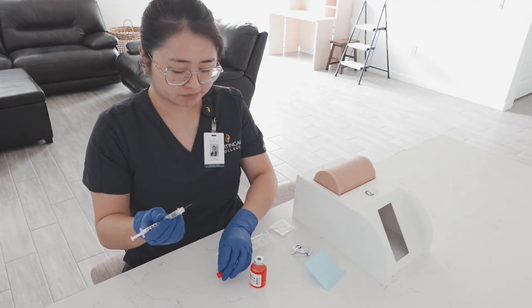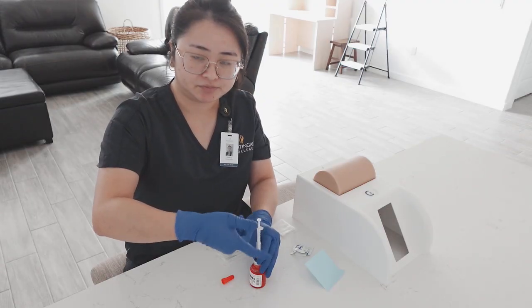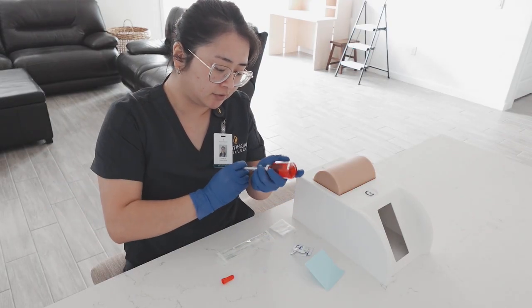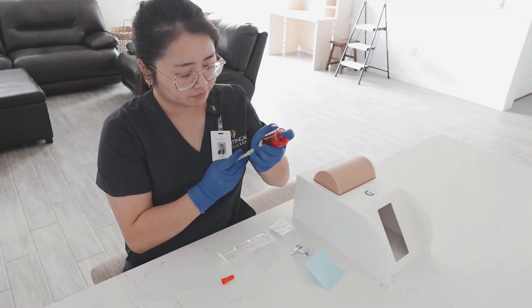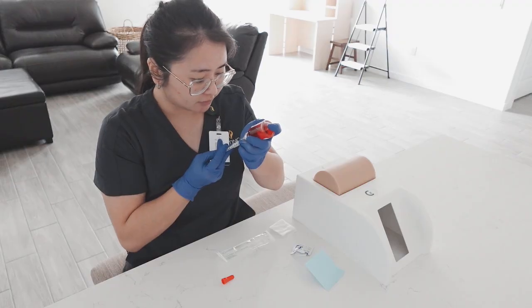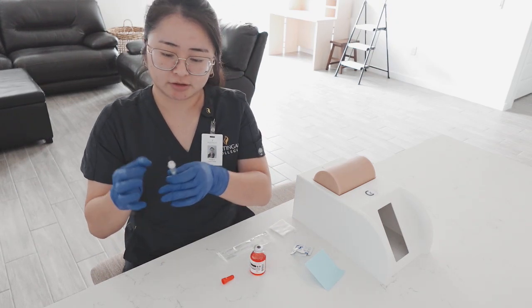And I'm going to take off the cap, put it down, insert the needle, inject the 0.1 air into the vial, invert the vial, and draw up 0.1 milliliters. We want to make sure that there are no bubbles.